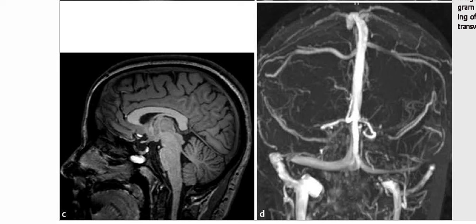The sagittal T1 weighted MRI shows increased cerebrospinal fluid in the sella with the flattening of the pituitary gland inferiorly. Increased T1 signal in the sphenoid sinus corresponds to the mucus retention cyst. This maximum intensity projection image here from the MR venogram shows the narrowing of the distal left transverse sinus.